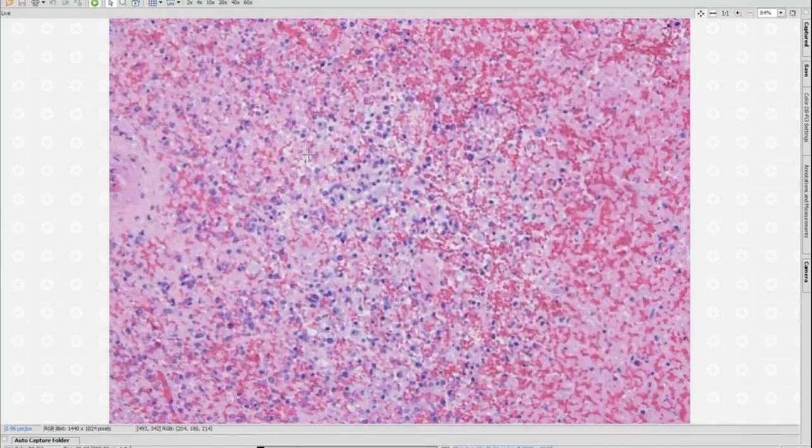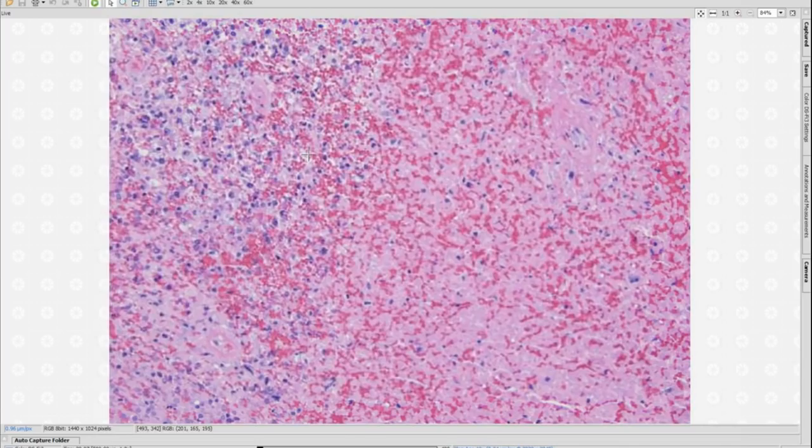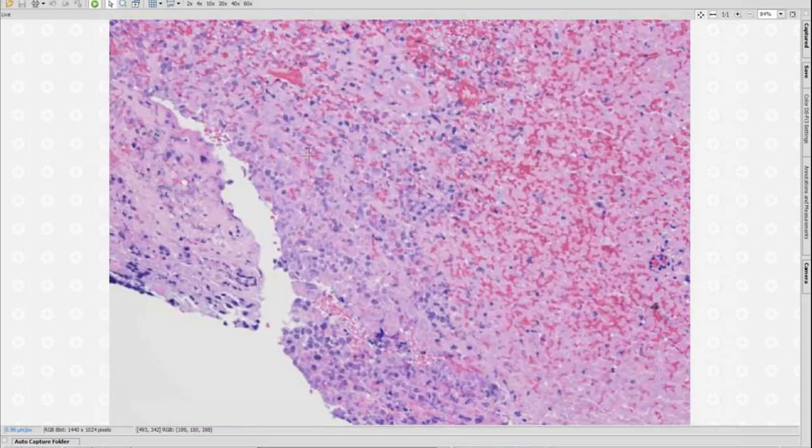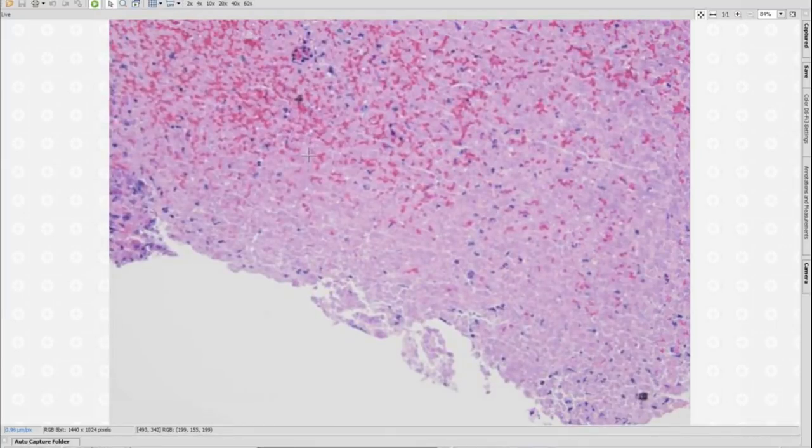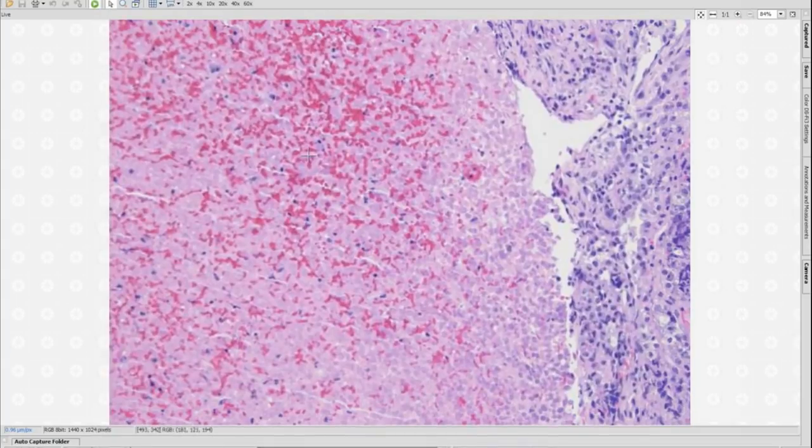And this is what we have. You still see a lot of blood, a lot of necrosis, similar to what you see in apoplexy. Apoplexy is in some ways a clinical syndrome, where you have sudden neurologic deficits and headaches, and basically an enlargement in the sellar region, often related to a necrotic adenoma. So it is something that is very typical.